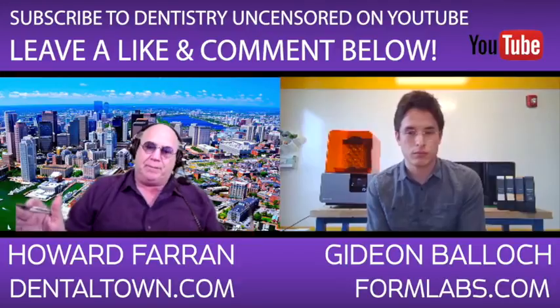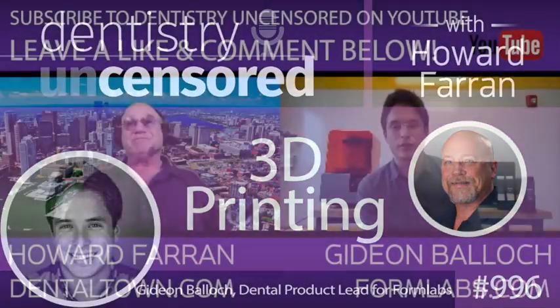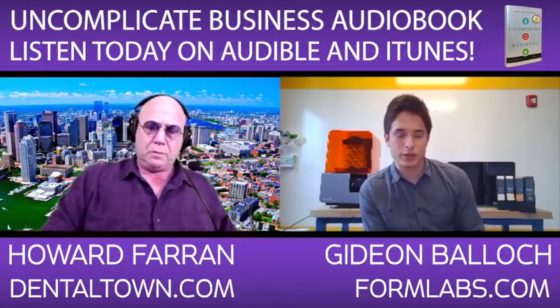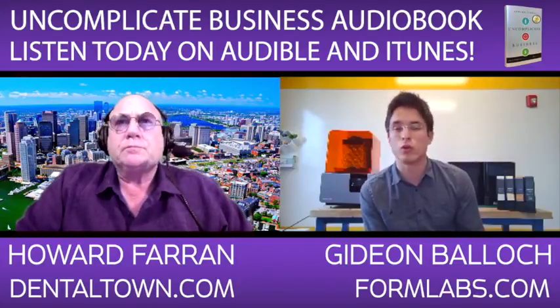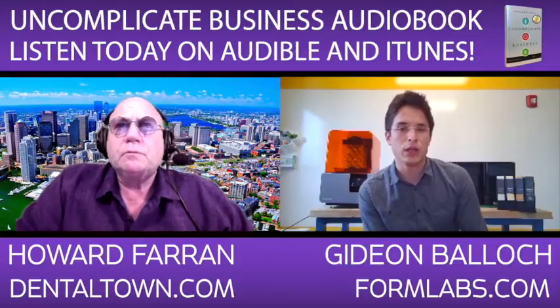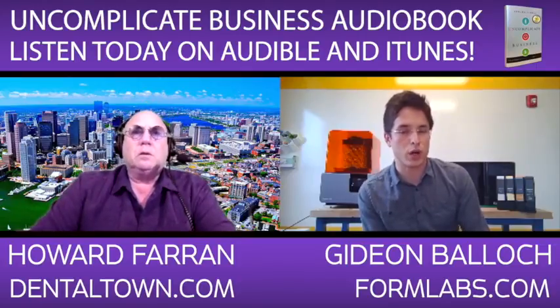Now, are there any big brand names that don't export STL files? Does Dentsply Sirona, or 3M TrueDef? Yeah, 3M TrueDef has open export to whatever dental CAD software you'd like to use. The big company that has been a little bit slower to pick this up was Dentsply Sirona, but even they're seeing that in order to grow in this space and retain customers, they have to open up that type of STL export as well. So in their CEREC in-lab software, it's possible to export the STL now for printing guides, for example. And I think they're going to continue to add that into their other modules as well.